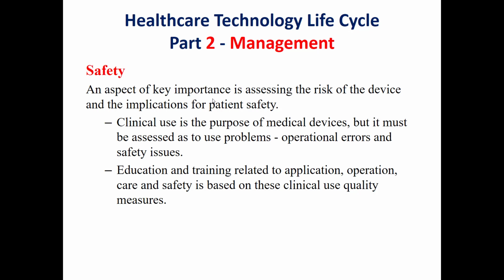One of the main reasons for the beginning of the clinical engineering domain is patient safety and the risk, especially the electrical safety risk, which has led to the need for clinical engineering departments in each hospital. So safety is still an important point for us, and we should consider it in order to ensure that the devices are safe to use with patients.